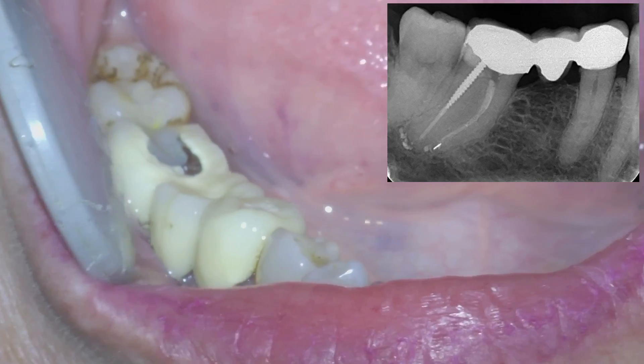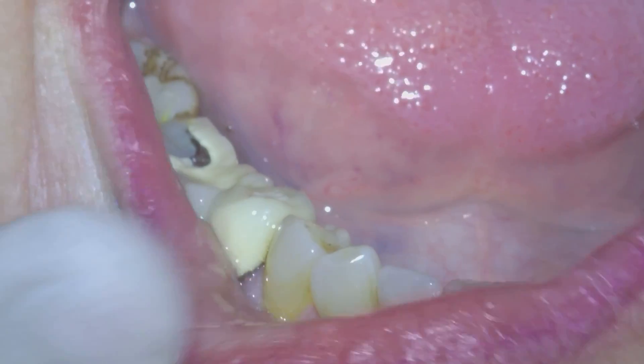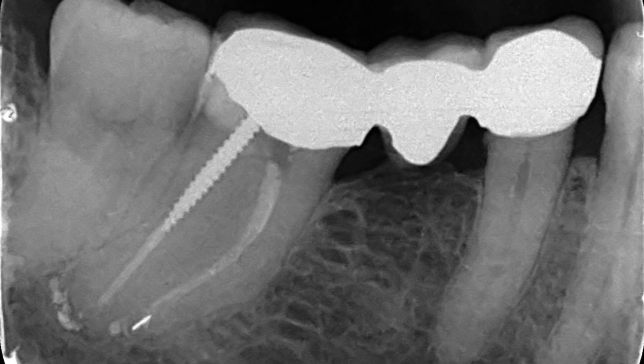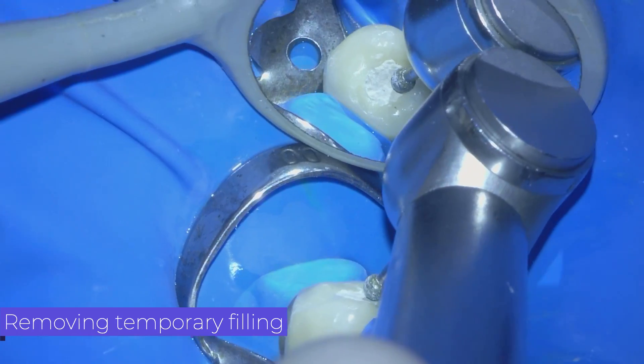Hello everyone. In today's case we perform an endodontic procedure through a metal-porcelain crown. The referring dentist has already performed the access cavity and the patient comes with a provisional restoration. We remove the temporary restoration with a small round burr.